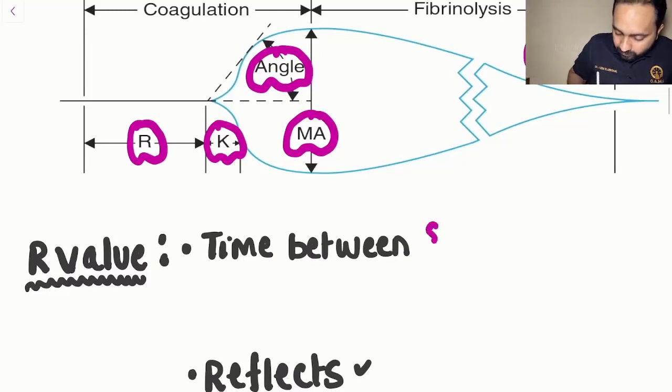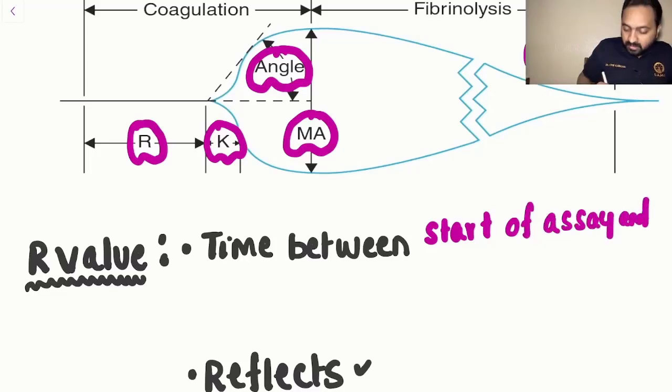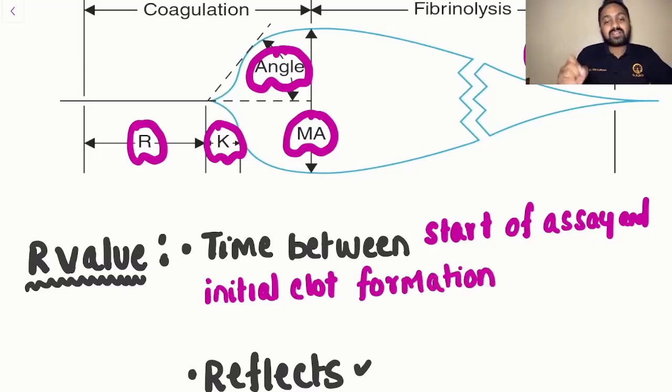So let me write it down for you: start of assay and initial clot formation.